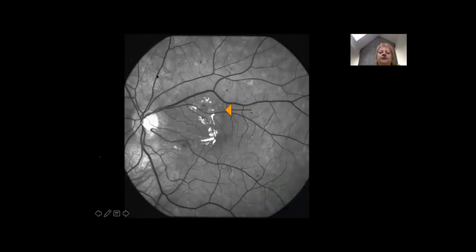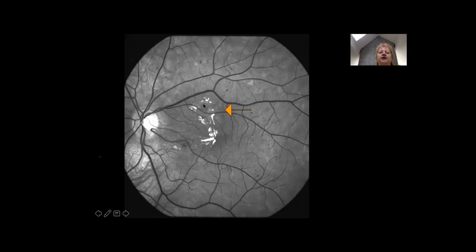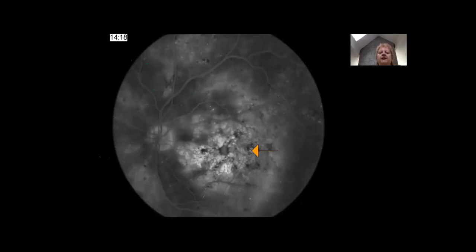This is another example of the fellow eye of the same patient with a focal area of circinate lipid maculopathy. You can see the early formation of a star lipid within the fovea — a high-risk eye for visual loss. The source of microaneurysmal leakage is within the circinate ring superiorly and temporal to the inferior temporal arcade, and those would be areas for potential focal laser treatment. A late angiogram of a similar patient shows accumulation of dye within the interstices of the retina typical for the petaloid pattern of cystoid macular edema. This is a patient that we would, as a first choice, treat with anti-VEGF therapy.